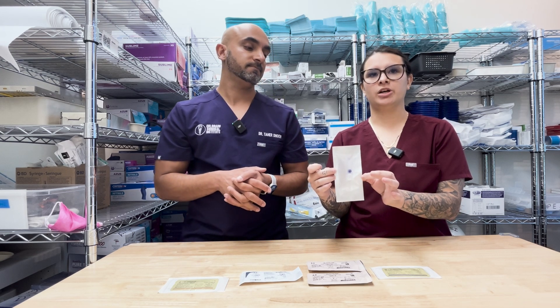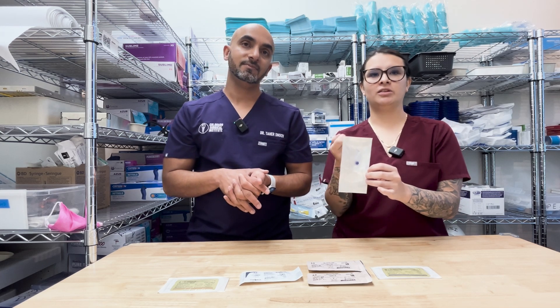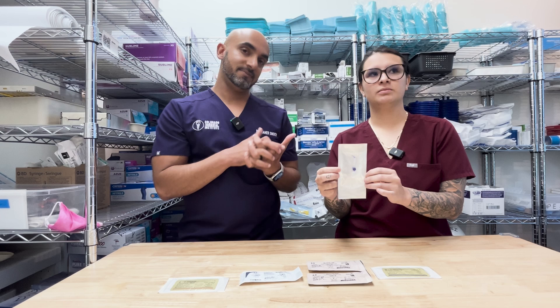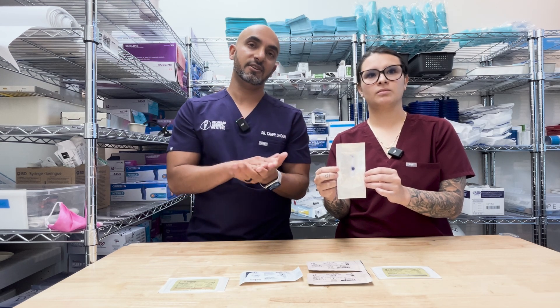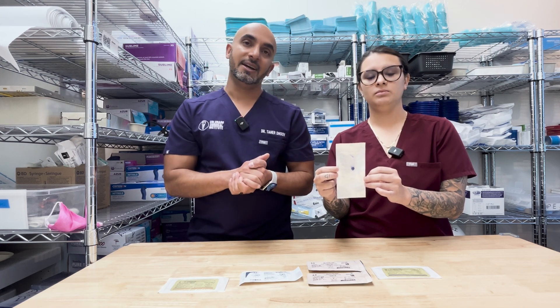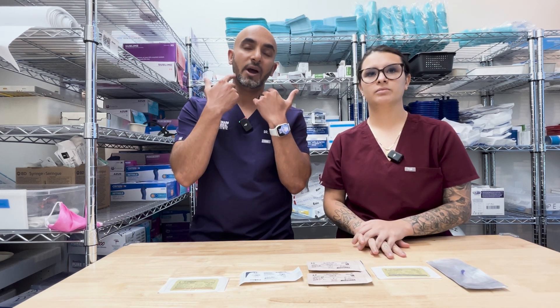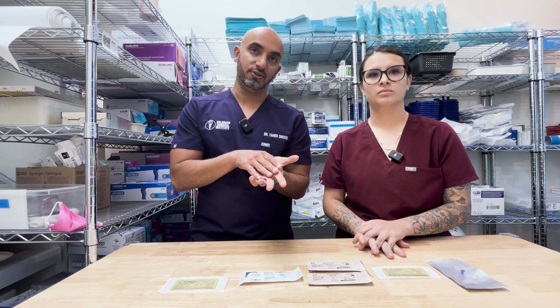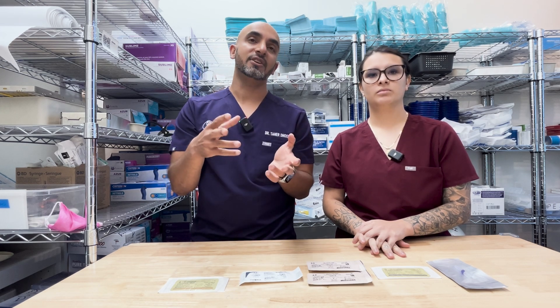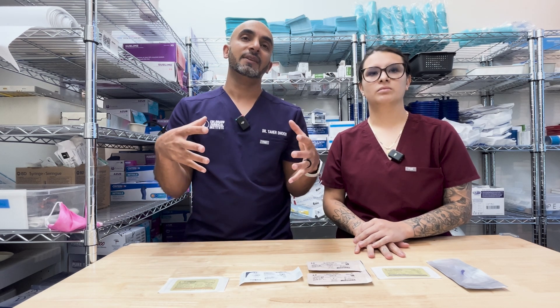If you do put this on, make sure you're not then putting gauze in the patient's mouth. Because if you rip the gauze out, you can only imagine what's going to come afterwards — that's a good pro tip. Make sure anything touching the tissue is wet or damp because it'll stick to the glue once it sets, and then you're doing yourself a disservice. Make sure the cheeks are also wet and not dry, because their cheek can stick to your suture and then they start to stretch the muscle and it can pull the stitches open. So be very intentional with where the glue goes and how you support the surrounding facial structures to make sure it stays nice and clean.